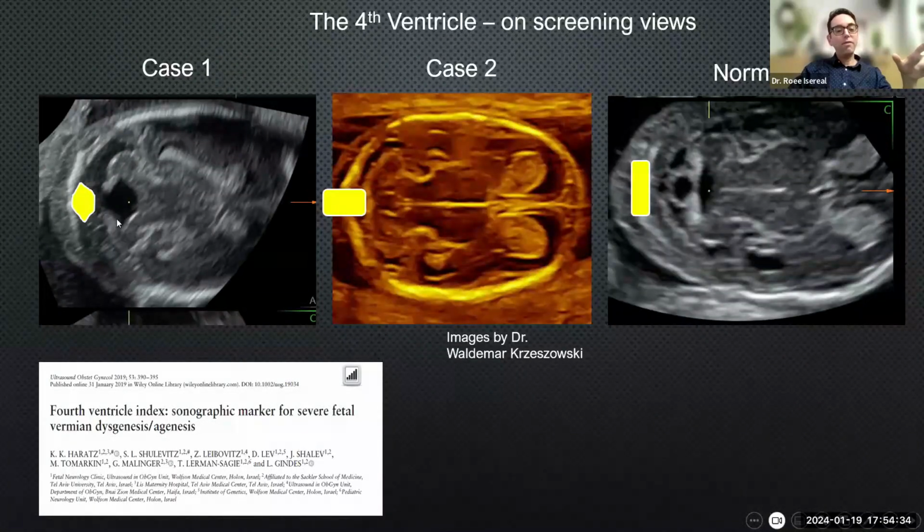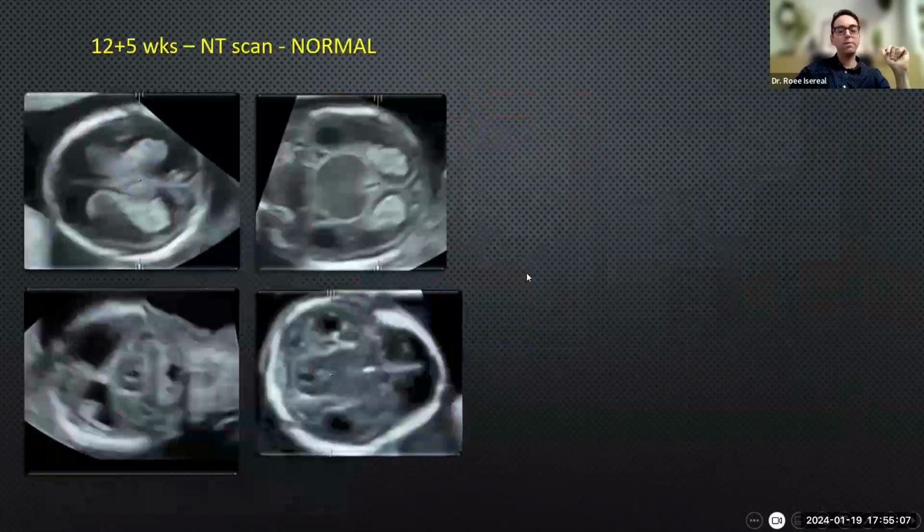However, in early pregnancy, in this case, there was a classic inverted fourth ventricle, but you may also have something in between because the superior cerebellar peduncles are still evolving. So even if you see this bizarre fourth ventricle, not the classical square one, you still need to think about it, because this phenomenon might appear a little bit later on. So bear this in mind. In both of these cases, you fail to visualize a completely normal fourth ventricle, as I showed you, because of the superior cerebellar peduncles.